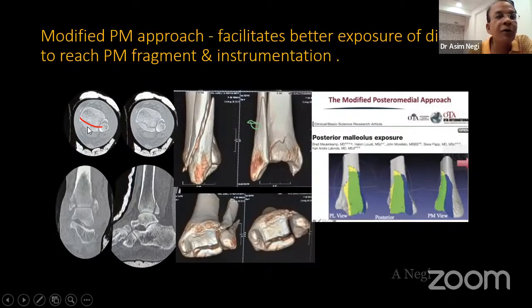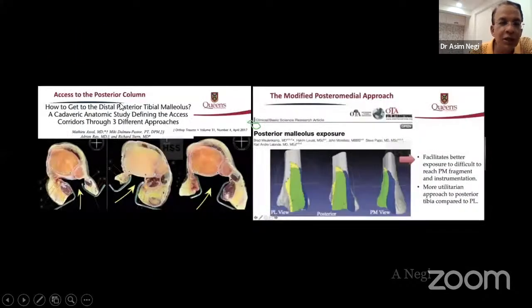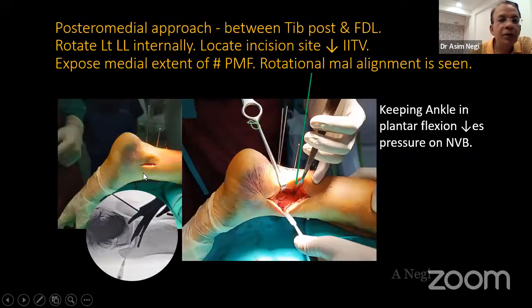The fracture going right across, as you can see here, from here to here. So I use a modified posteromedial approach, which facilitates better exposure of the difficult to reach posteromedial fragment and its instrumentation. You can go either close to the vessel or medial to the tibialis posterior and FDL. So we located the medial part of the fracture there and took a posteromedial approach between tibialis posterior and FDL. So the neurovascular bundle was protected by FDL.